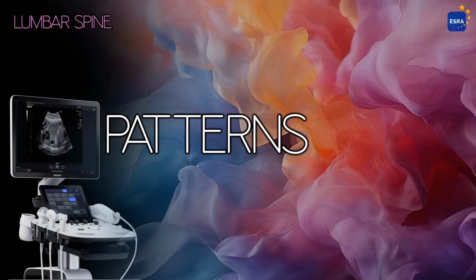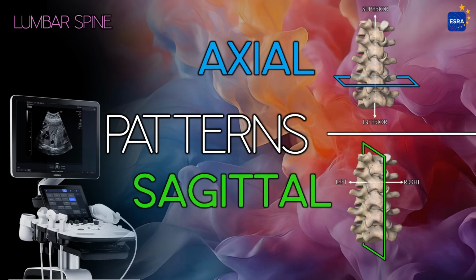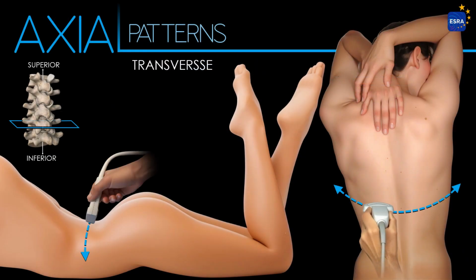We will describe the examination axes at the lumbar level, specifically the axial and sagittal axes. The transverse plane, also known as the axial or horizontal plane, is parallel to the ground and divides the body into superior and inferior sections.